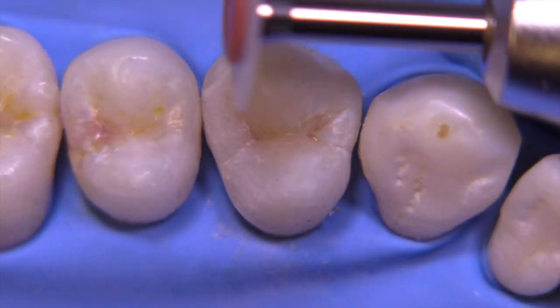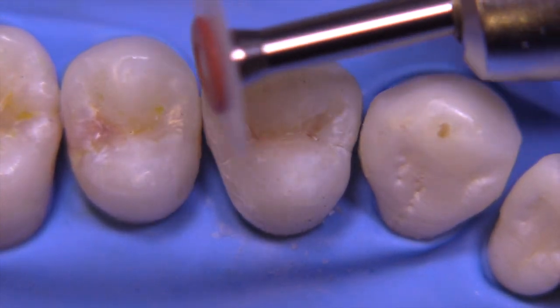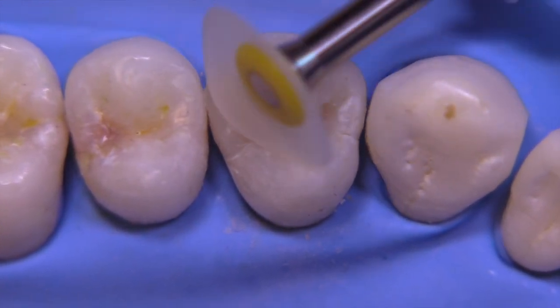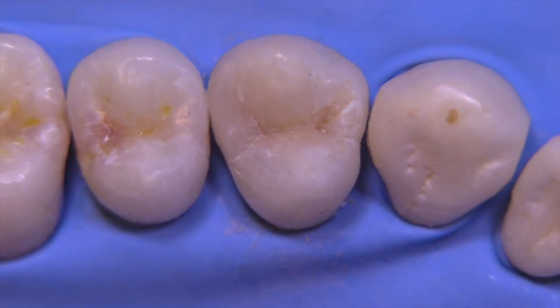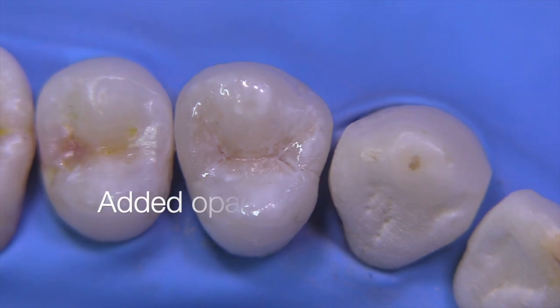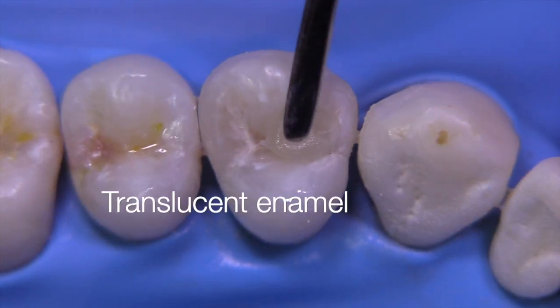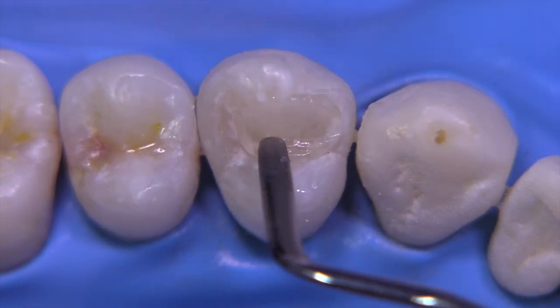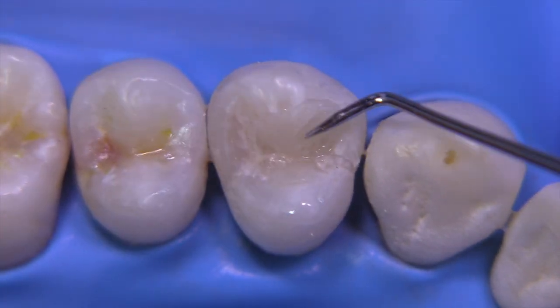I still have an under-contoured restoration and I want to get everything just about finished, and then I'm going to treat the surface with acid etch, clean it, bond it, and then place an opaque layer because I didn't like how dark this composite was looking. Then I'm going to place translucent enamel on top of that to get our final contour. This is the last step to lock everything in.